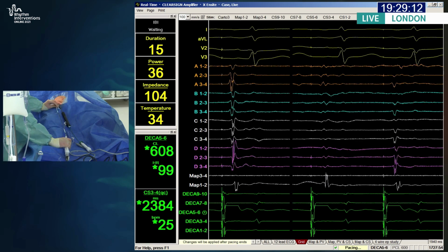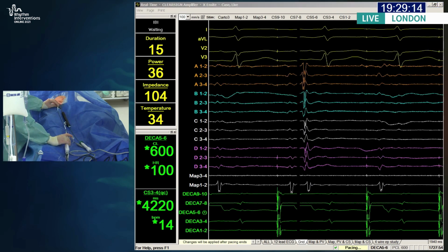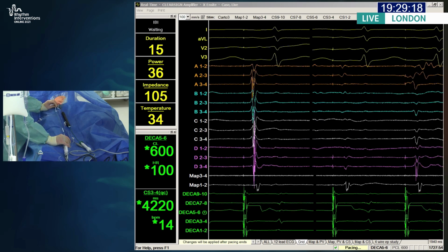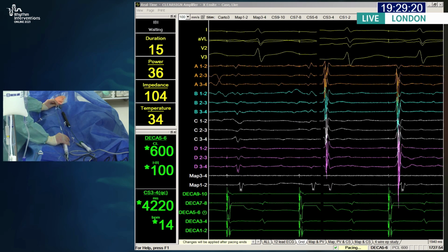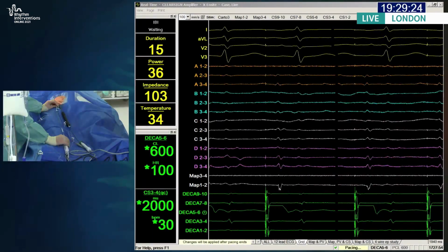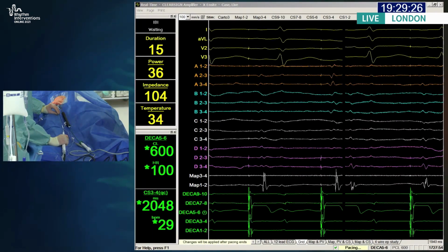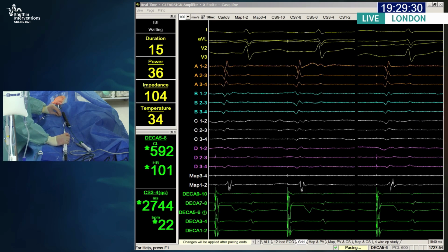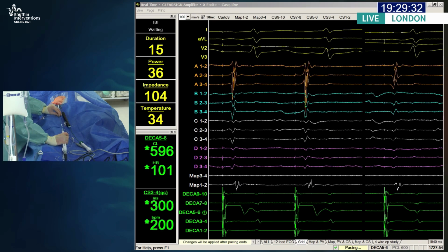We don't know. I suppose another thing is they're under sedation. So if people are feeling a lot of pain, they tend to move. I suppose a lot of the data for fistulas may be linked to TOE. Can I have a PA on the left? Yeah, but essentially we don't monitor the esophagus. I suppose it can be done, but it's not an easy thing to do under sedation.